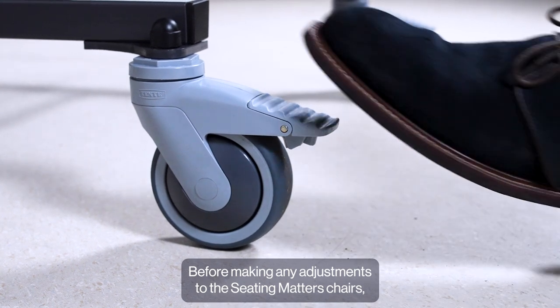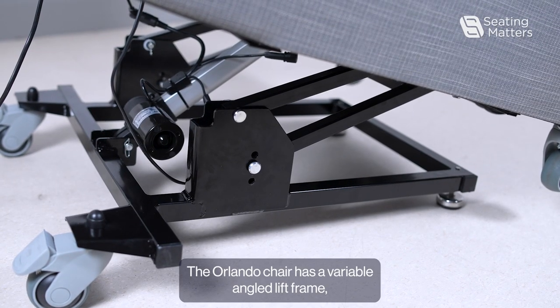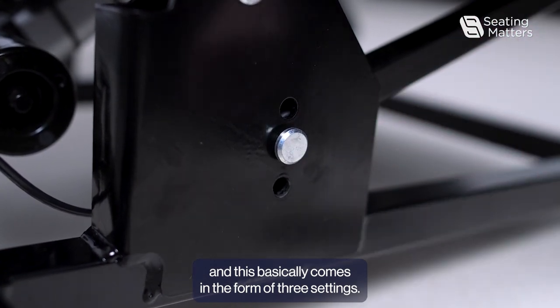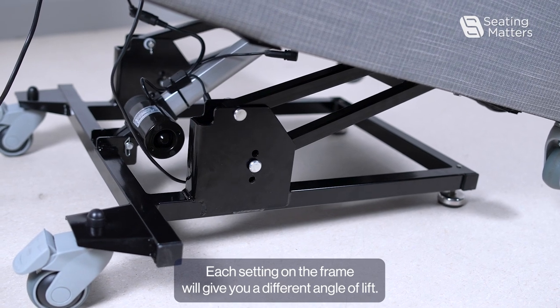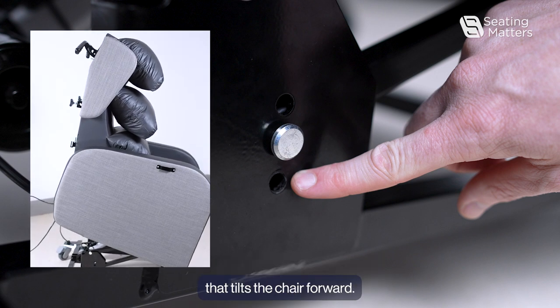Before making any adjustments to the Seating Matters chairs, lock the two brake casters at the back of the chair for safety. The Orlando chair has a variable angled lift frame, and this basically comes in the form of three settings. Each setting on the frame will give you a different angle of lift, so the bottom hole will give you more of a lift that tilts the chair forward.